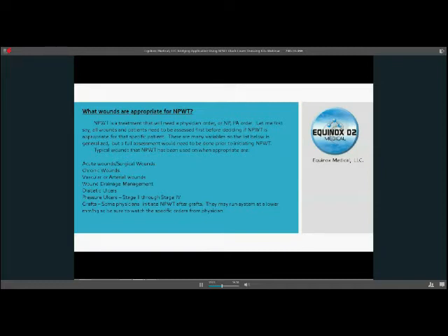Chronic wounds, a lot of times, can be re-stimulated back. Vascular and arterial wounds. Wound drainage management is a big situation that this is very helpful in. That's when you'll see some hospice patients utilizing it, and that would mostly be for comfort and dignity. Diabetic ulcers, pressure ulcers, we can treat from stage 2 through 4.